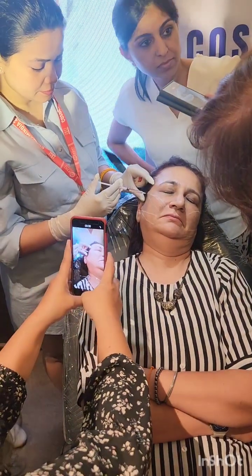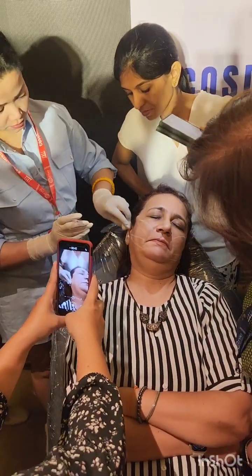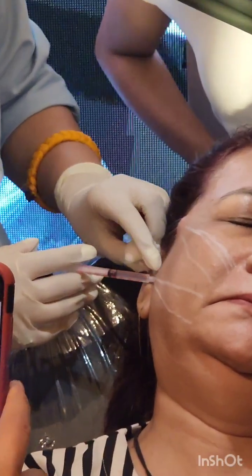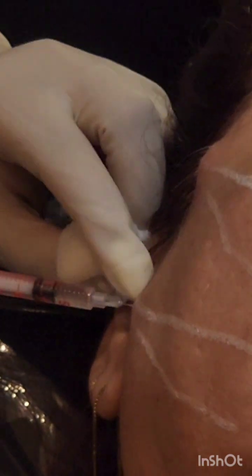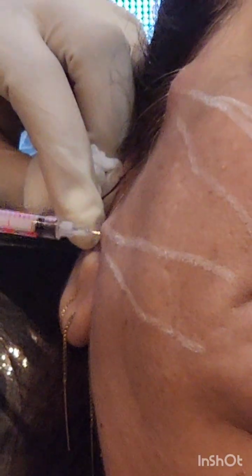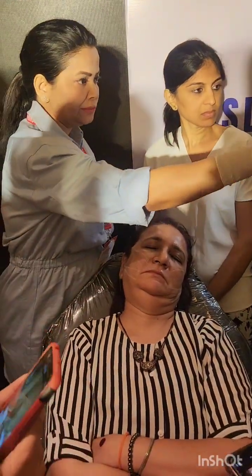And over here, if it is monothread, if it's superficial, but if you're doing a cog, this will be inside the skin now. It's not coming out. Cogs only it comes out. When it comes out at the entry point, the thread is moving, then you get it.